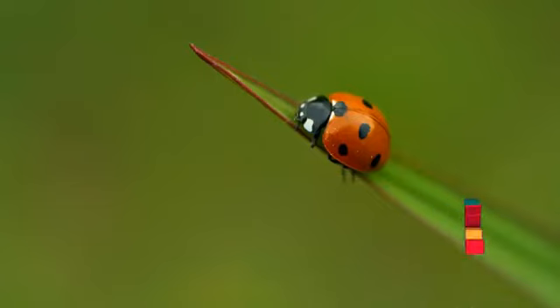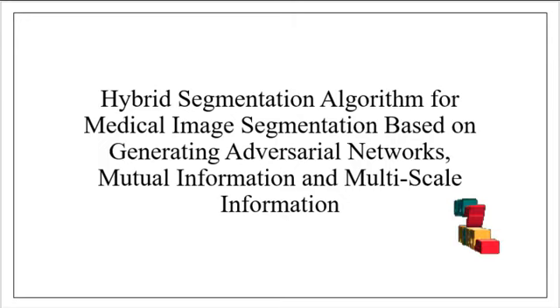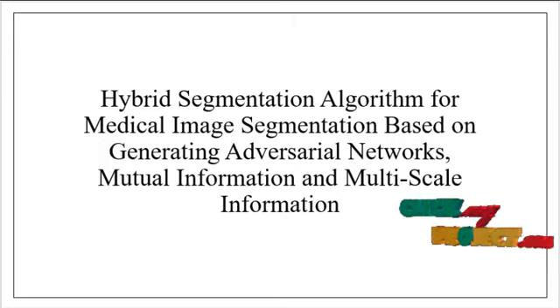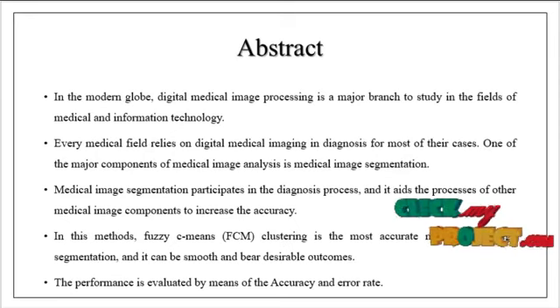Welcome to ClickMyProject.com. Now we are going to discuss the project, a hybrid segmentation algorithm for medical image segmentation based on generative adversarial networks, mutual information and multi-scale information.